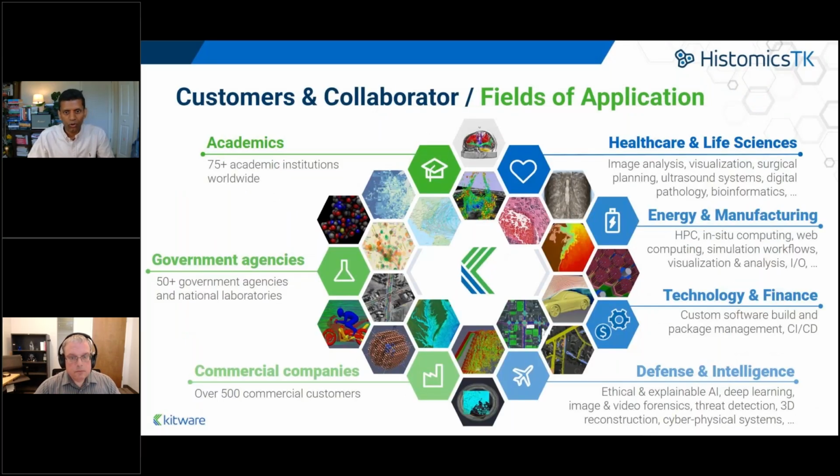We are a highly collaborative company with research efforts primarily funded by the US federal government, involving commercial and academia as well. We provide custom development, support, and training on open source platforms. Our expertise spans healthcare and life sciences, including digital pathology, surgical planning, medical imaging, and bioinformatics, plus energy, manufacturing, and defense applications focused on simulation, HPC, and data analysis. Deep learning is central to our work with a strong emphasis on ethical and explainable AI.